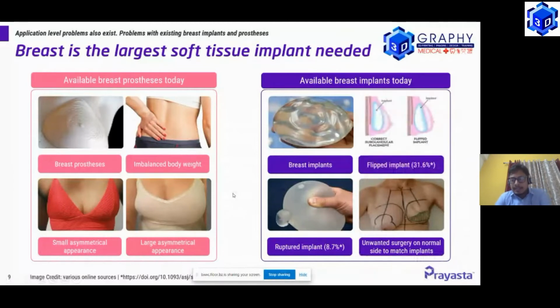The second thing is the flipping or malpositioning of these implants. Because of the structure itself, breast implants cannot be anchored or sutured to the body, neither temporarily nor permanently, so they are simply kept inside the body by making a pocket. Depending upon the physical activity of the woman, they can get displaced from their position, rotate, or even at times flip.